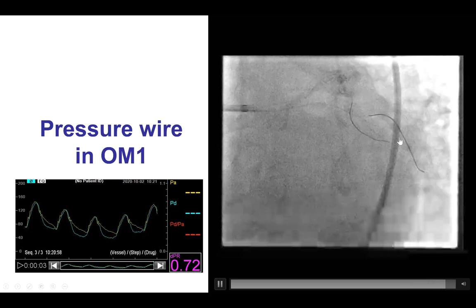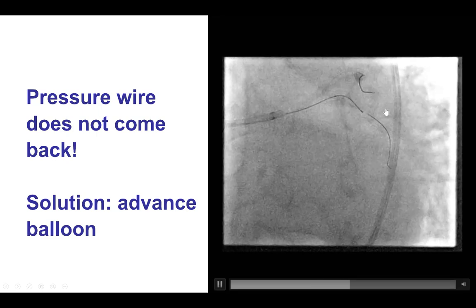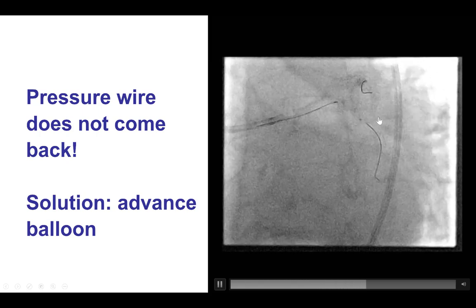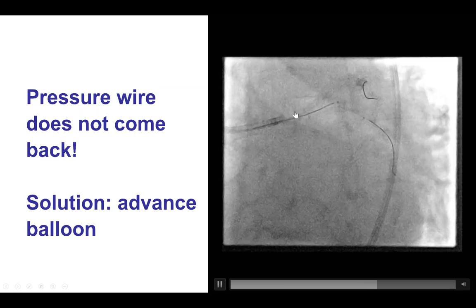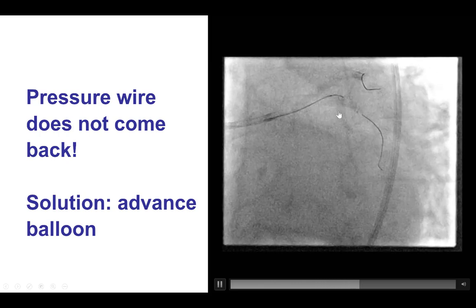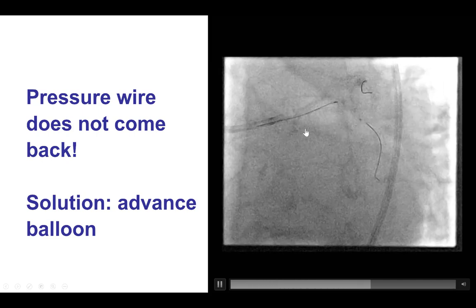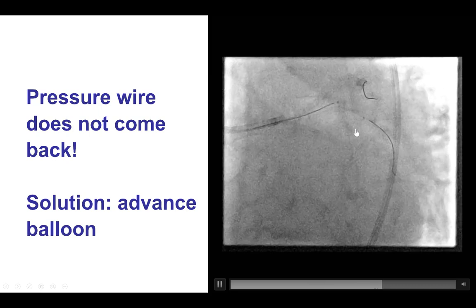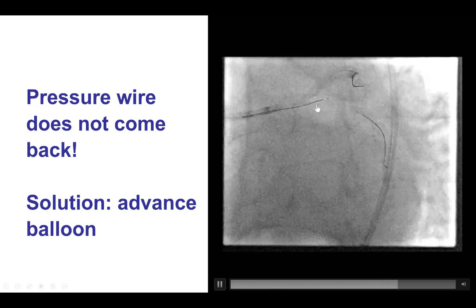Something more needed to be done given how large this branch is. We had a little difficulty — the pressure wire would not come back. The key thing when this happens is to not pull hard, as that may cause rupture of the wire and create a worse problem. The solution is to advance a balloon or microcatheter as far down as possible, which provides more leverage for pulling back the wire and often frees it from where it's been entrapped. We advanced a small balloon; it appeared the wire had gone under the struts of the stent, and by putting the balloon far down, we were able to successfully remove the guidewire.